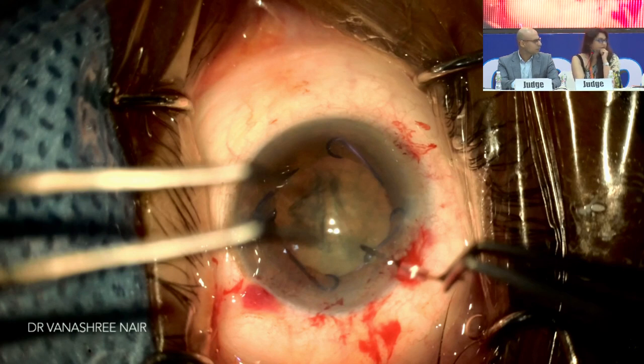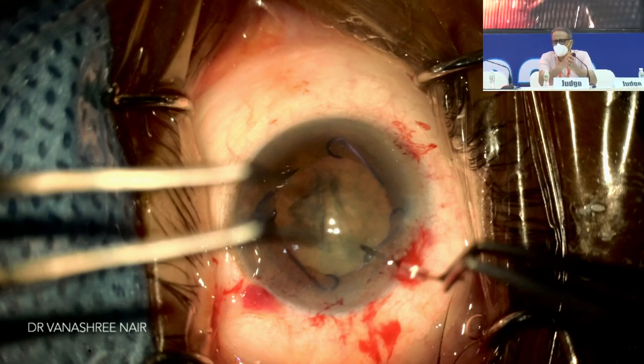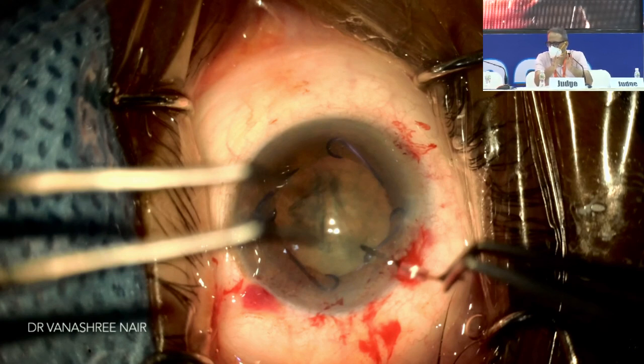I fully agree with her, because capsular hooks should be the first line of action. With the capsular hooks, you are trying to create anterior-posterior support. You are anchoring and immobilizing the bag. At this stage, we need more of an anterior-posterior support. Horizontal support is required if you find that the nucleus is soft, because when you do the emulsification, the bag can be aspirated. So that can be delayed, as she has already said.